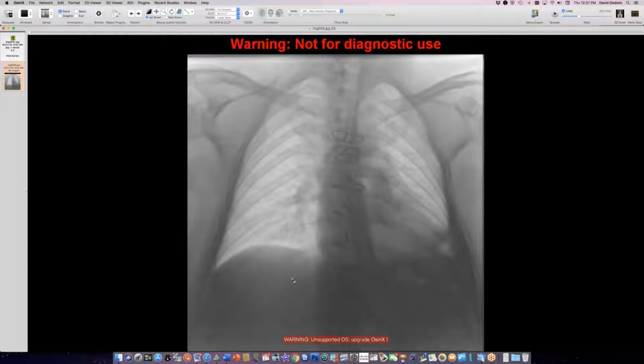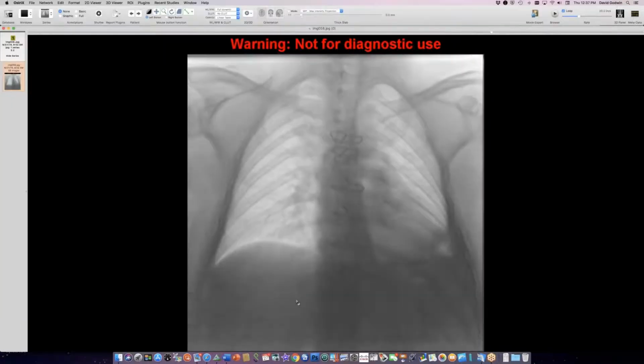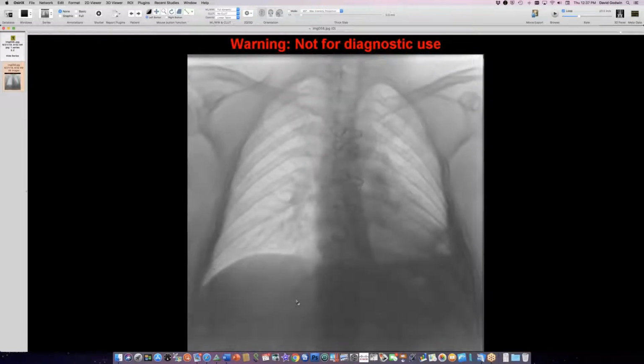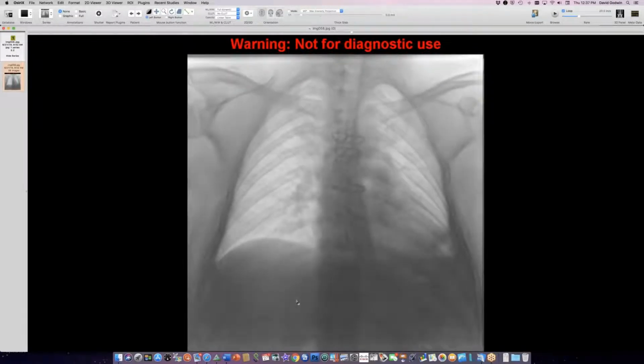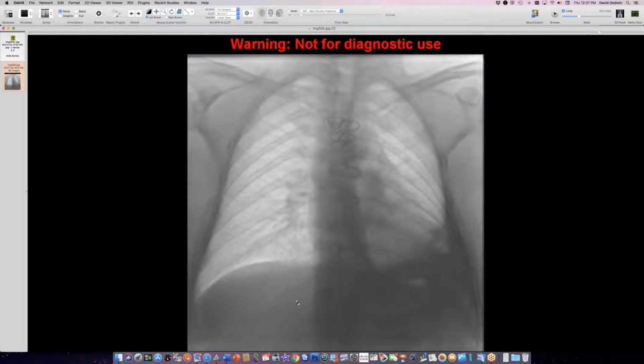So I wanted to show you how you can restrict diaphragm motion from a pleural process. And it should not be mistaken for paralysis. It's diaphragm dysfunction, but it's really tethering by the pleural process. So I'll just go through the series here of deep inspirations. And so you can see that the right hemidiaphragm moves very, very nicely. It exceeds 1 rib interspace excursion, which I consider the lower limit of normal. David, it goes past 1 rib, so more than 1 rib interspace excursion.